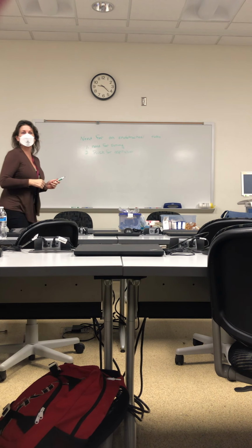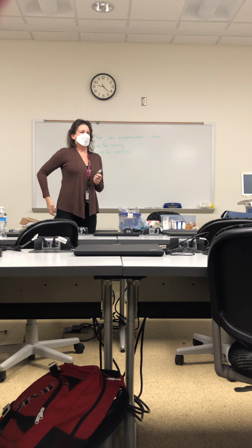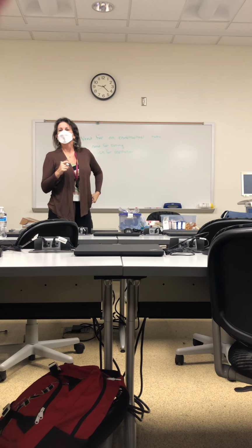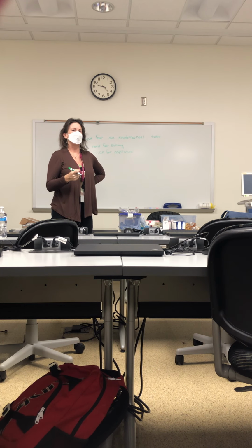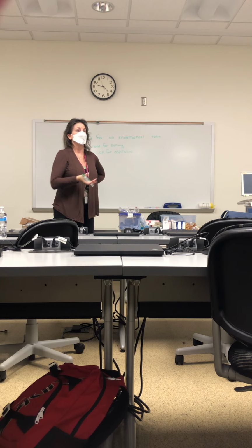So somebody that might not really be responsive, right? Give me a scenario where somebody might not be responsive and you have to put an endotracheal tube in them in order to protect their airway so that they don't aspirate food into their lungs. Somebody that maybe had a brain bleed, so maybe they had a stroke, a CVA, cerebrovascular accident, and they are unresponsive, and now they're at risk for aspirating what they had for lunch, okay?